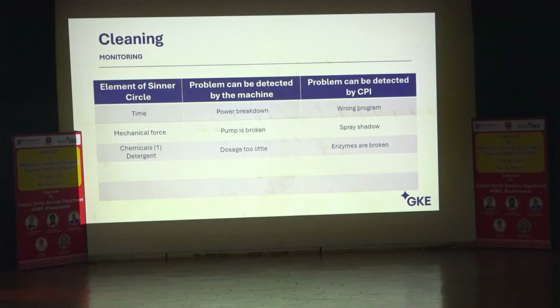And if in the summertime this brown UPS vehicle is parked in the sun, and at 6 p.m. at last this container is delivered to the dentist, then the enzymes are broken. Forget it. And then we get a telephone call and they say your indicators are not clean anymore, we just connected a new container of detergent. What kind of indicators are these? And we say, oh, we already have the reason. You have received a container with detergent which is not okay anymore.